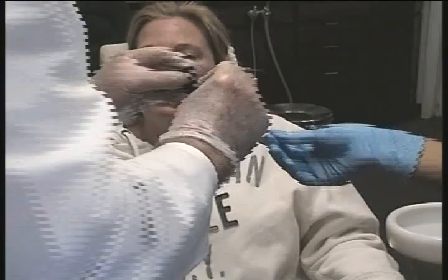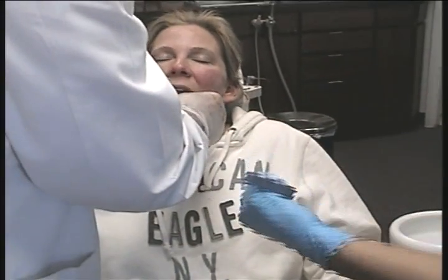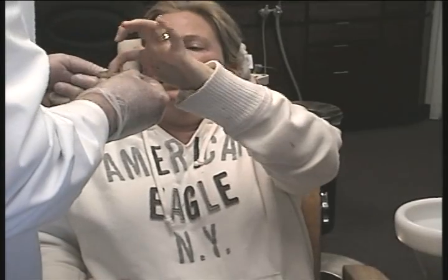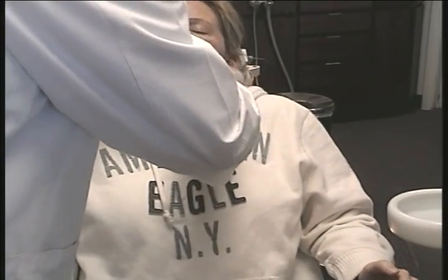There's a high dot right over here, but otherwise it should be good. Much better, the left and the right side seem. You like that, huh? Yeah. As I take the appliance in and out of her mouth, adjusting it each time, notice that when I insert the appliance, her head and facial movements and blinking greatly diminish. And then when I take it out for the adjustment, they return. And then when I put it back in the next time, they greatly diminish.